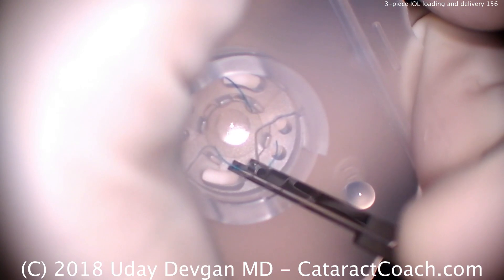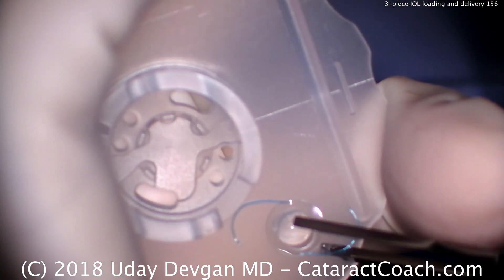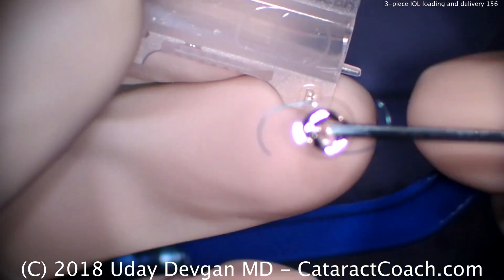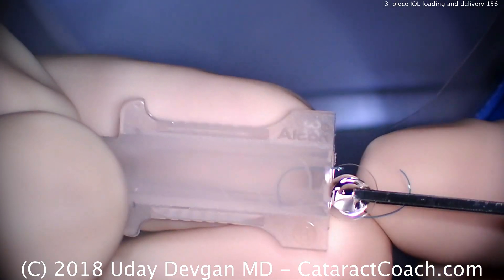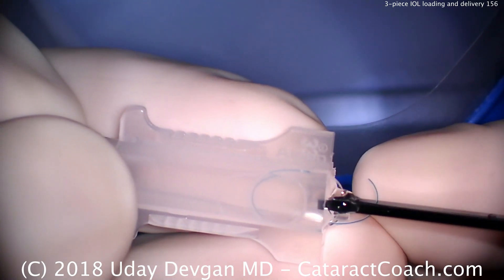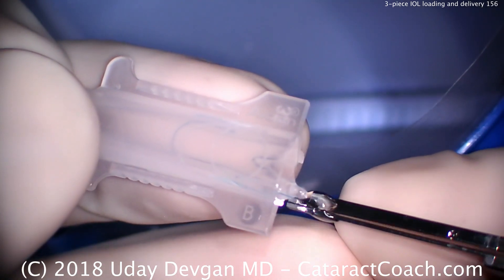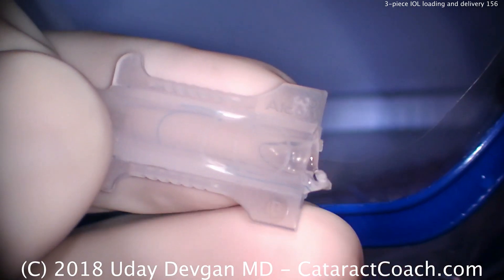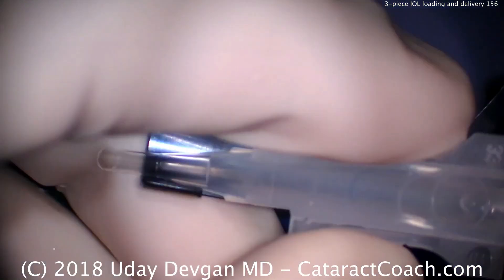Here comes the lens — we'll pick up the lens, and it's in the correct orientation. This is not a planar lens; it has an angulation to the haptics, so it's very important to have it in the correct orientation in the eye. There's the picture to match it up. Don't fold the leading haptic over — keep it straight. Push the optic and get it down the barrel of the cartridge. Very importantly, get the trailing haptic and put it on the outside of that peg.